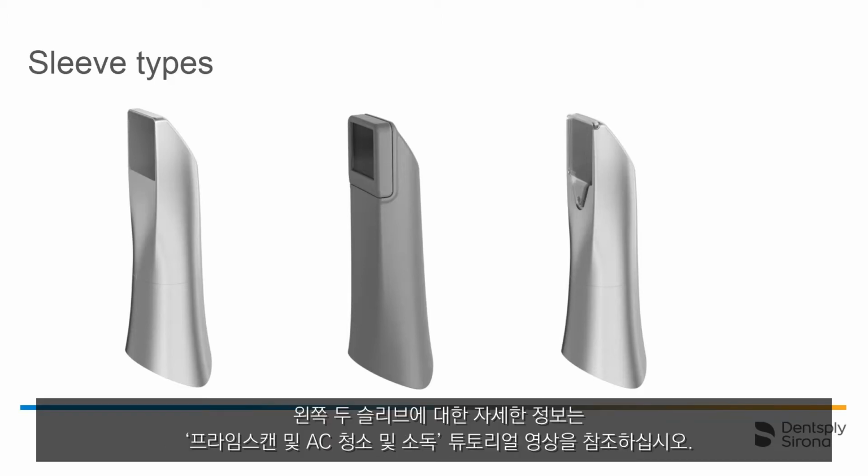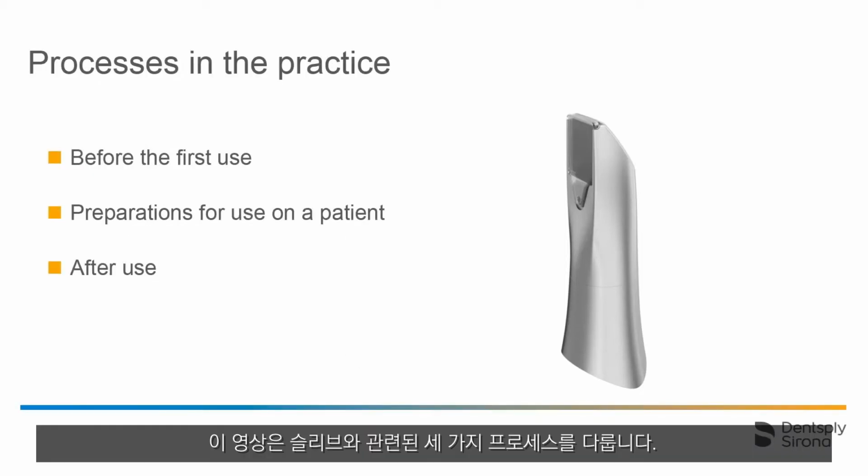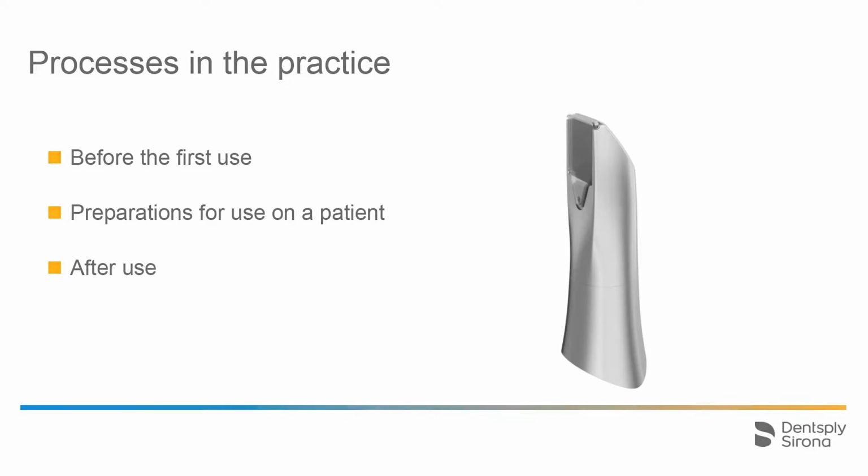For detailed information about the first 2 sleeves, please refer to our video tutorial entitled Primescan and the Acquisition Center, Cleaning and Disinfection Procedures. This tutorial focuses on the new autoclavable sleeve with disposable window. In this video, we will cover 3 different processes associated with this sleeve: the workflow after unpacking but before the first use, preparations for use on a patient, and the process after use.